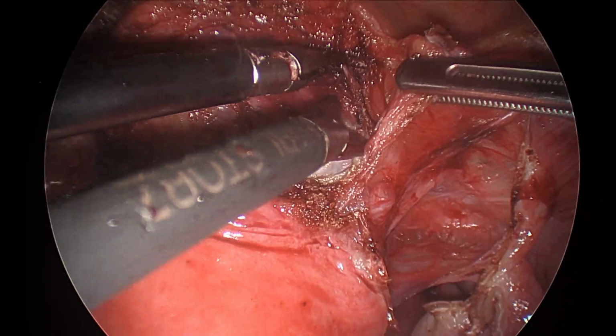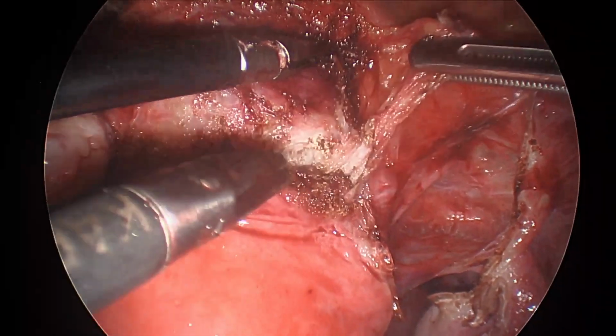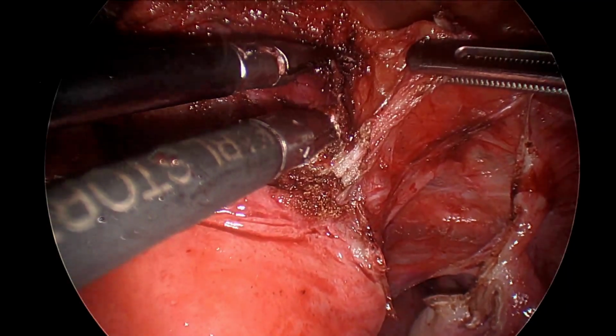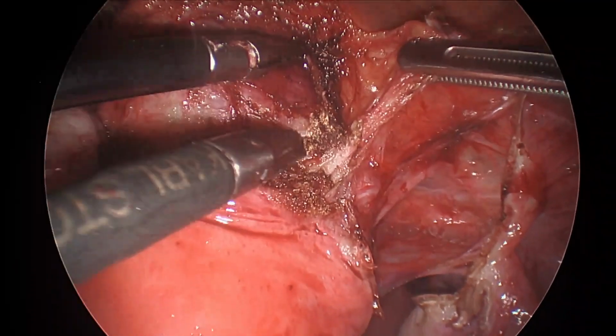When bleeding is encountered during this bladder flap dissection, the Metzenbaum scissors are seen hovering over the tissue and are activated with a coagulation current. If you look closely, you can see sparks as a result of the ionization of air. This technique essentially allows for painting or charring of the bladder peritoneum and subsequent haemostasis.